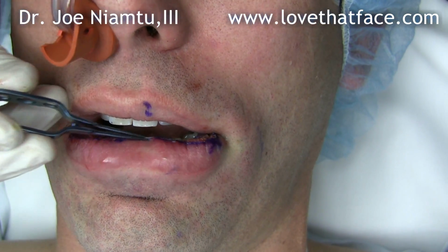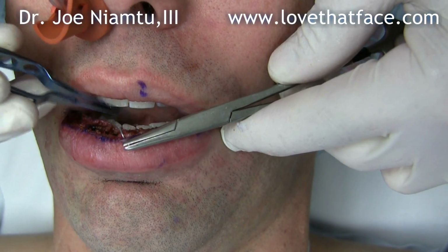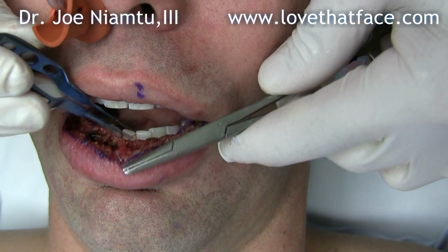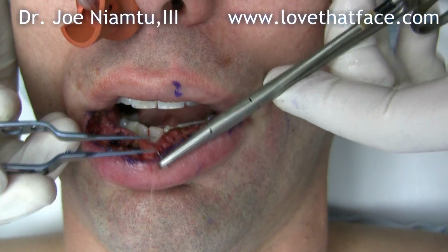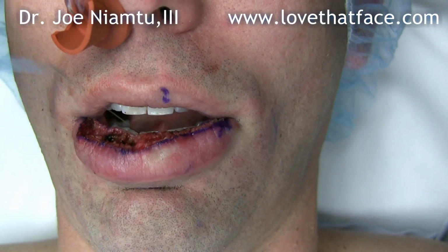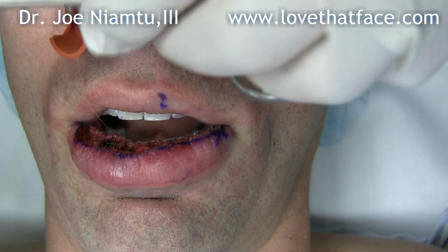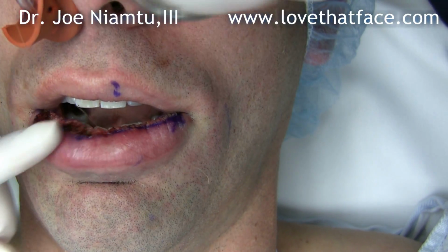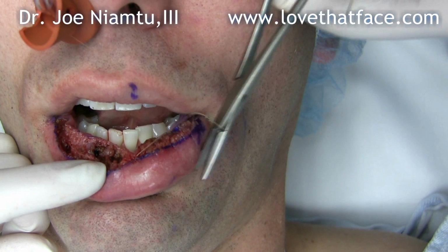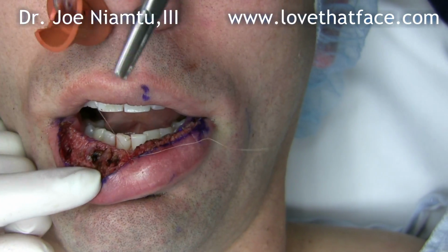We're going to put some 5/0 gut key sutures in, and I like to close this with sutures that have to be removed. I don't want to use dissolvable sutures for my final closure because they have a tendency to come out. So I like to use a 6/0 silk suture and leave that in for about 9 days. So we're going to go ahead and put several key sutures in here to line our anatomy up properly.